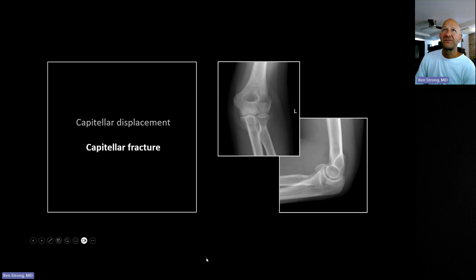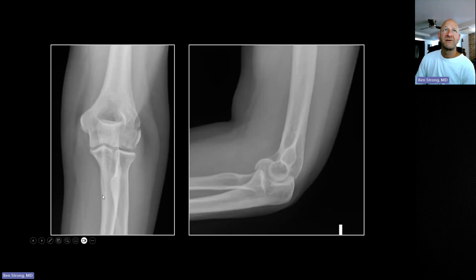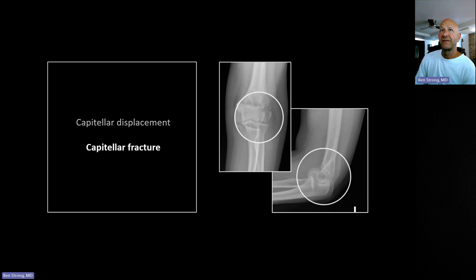Capitellar fractures can be tough to sort out. Here's another one that rotated slightly laterally rather than straight superiorly, producing an added density on the frontal view, with no proper rounded capitellum articulating with the radial head. On the lateral there's a nice large elbow effusion — a sail sign — and probably a posterior fat pad as well. This is a capitellar fracture.